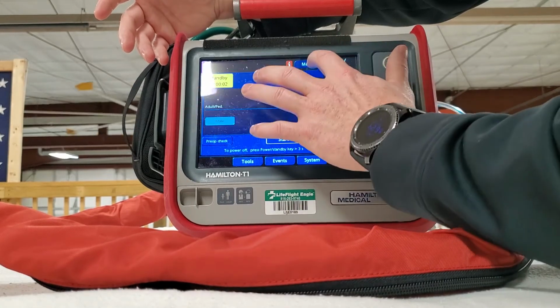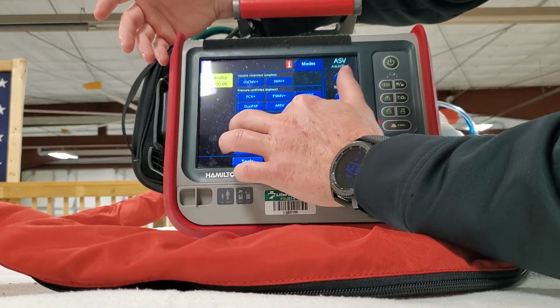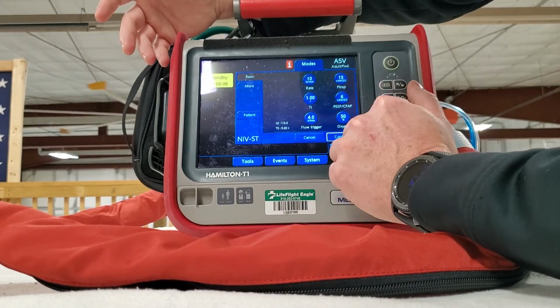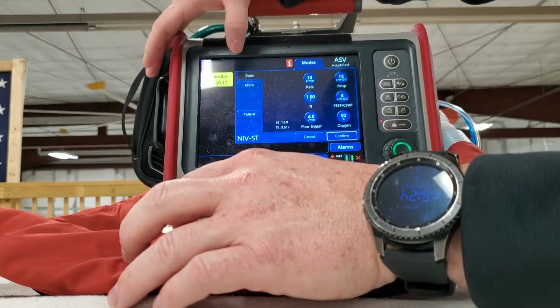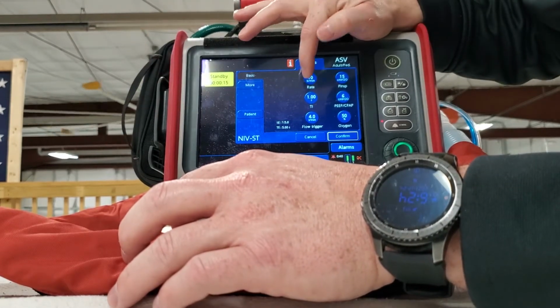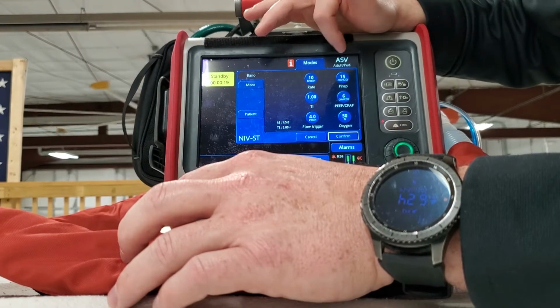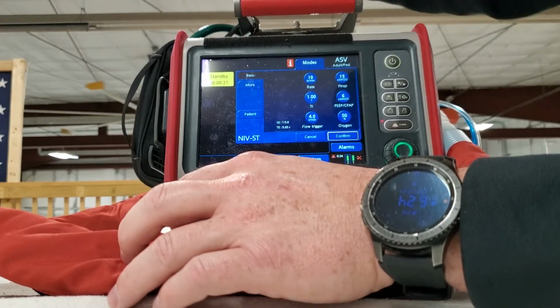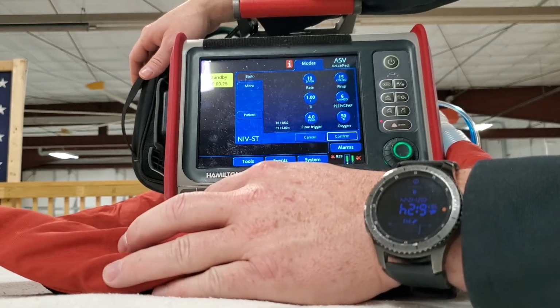We'll go into modes and then run through the NIV real quick. Gotta hit confirm. So then this, your basics. This is the apnea rate that I was telling you about. This is NIV ST. Now if you watch, if I leave this alone, it will cancel itself out.